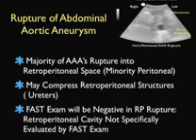Interestingly enough, the FAST exam will be negative in retroperitoneal rupture as the retroperitoneal cavity is not specifically evaluated by the FAST exam.